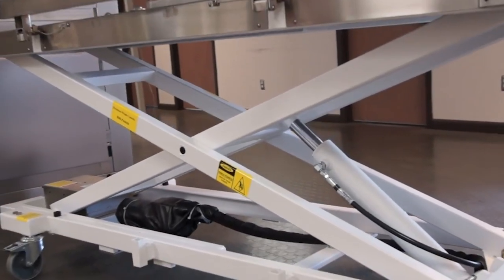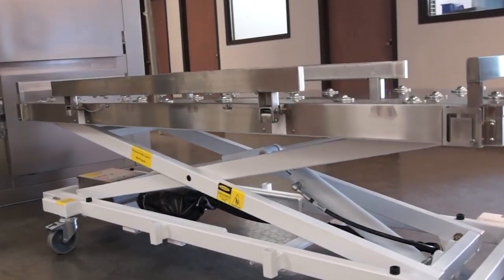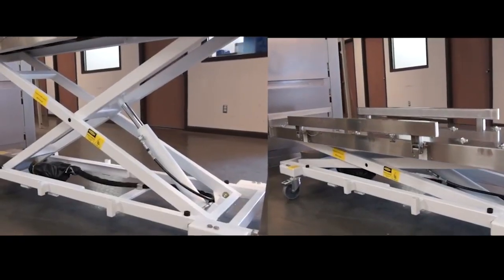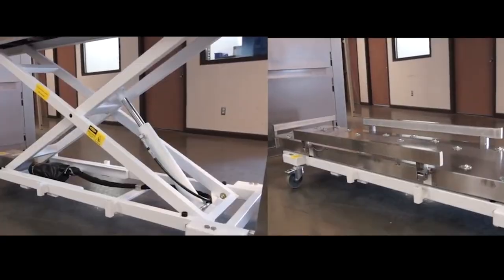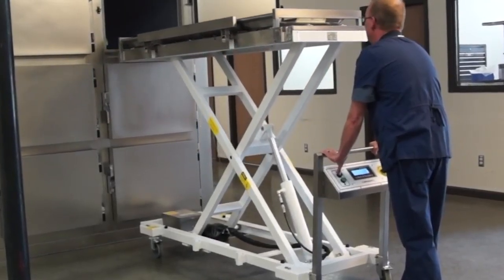The single scissor design was created as a simple structure that allows for a more balanced load. Using the hydraulic system, Red Wing lifts can hold up to 800 pounds and, excluding the economy model, can reach over seven feet high.